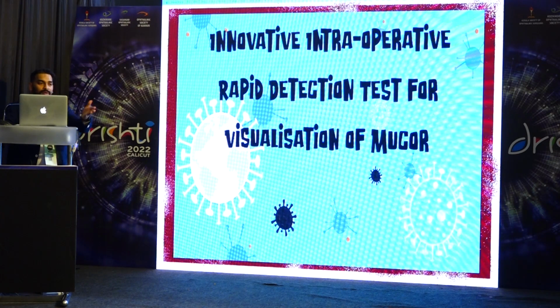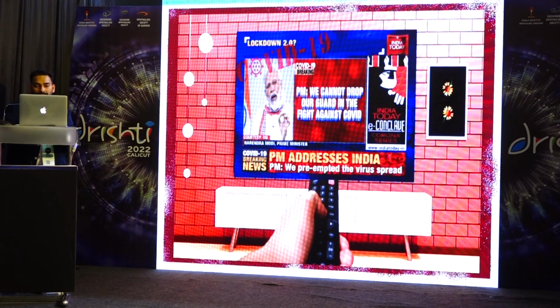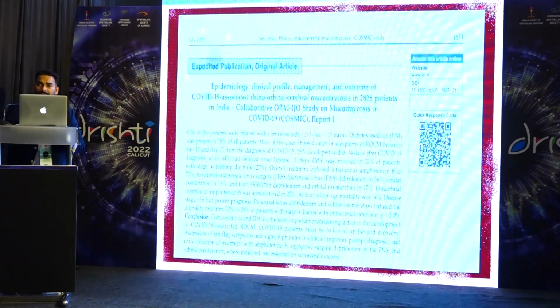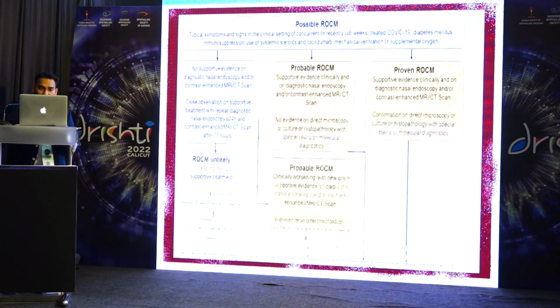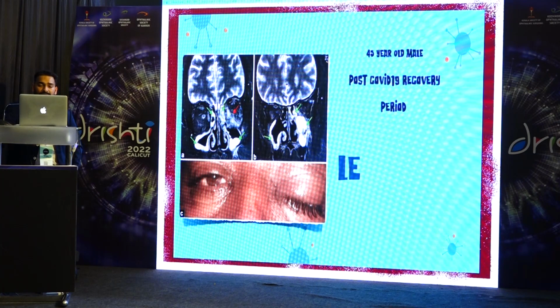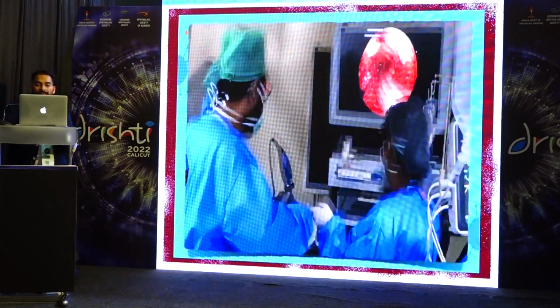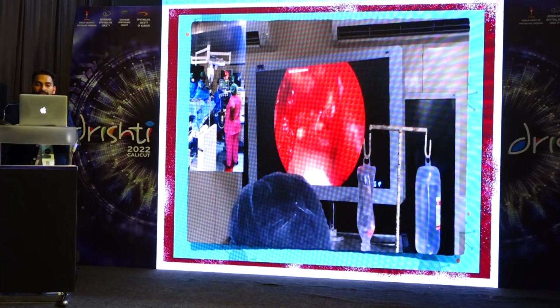So what happened is, my dear friend Dr. Prasanna had called me during the COVID time. It was a very crucial time where COVID-19 and mucormycosis were spreading. There is a lot of literature on mucormycosis and also ROCM, so we needed extensive debridement in the paranasal sinuses. The ENT surgeon needs to find out whether the debrided area has the fungus or not. So he called me up and asked if my IOL scope can detect the fungal hyphae. I said, why not, we could try that.